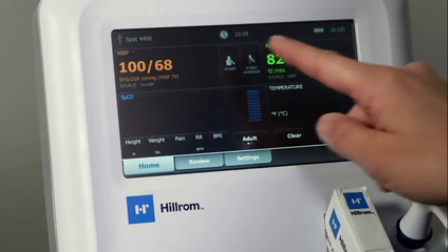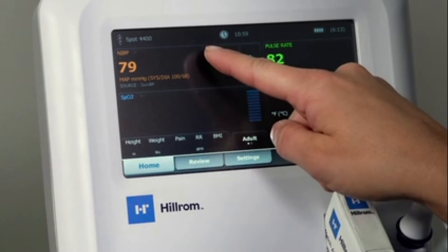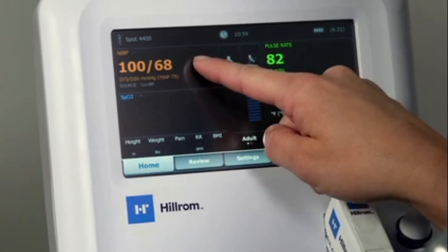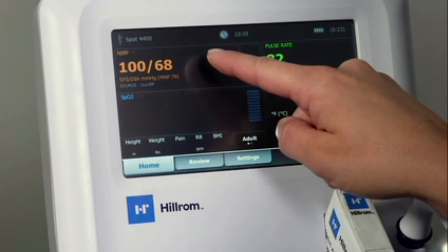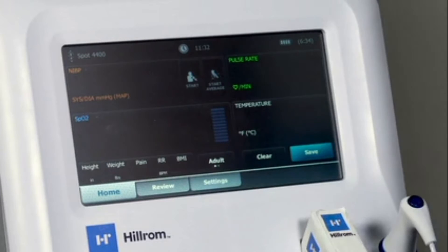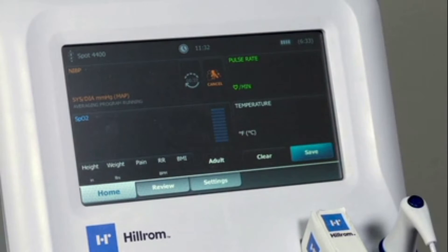Touching the BP tile will display the mean arterial pressure reading associated with the BP. The mean arterial pressure will remain on the main tile until you touch the tile again to toggle back to the systolic diastolic display. You can also manually type in a BP measurement by touching and holding on the BP tile. If you would like to take and average multiple BP readings automatically, simply touch Start Averaging instead. You can learn more about this in our BP Averaging video.